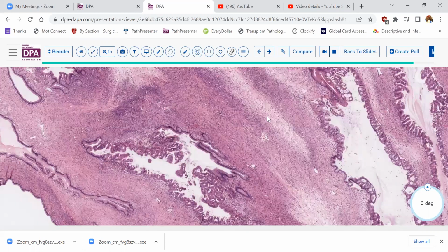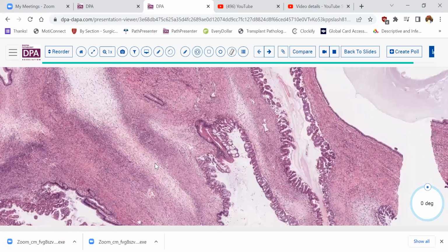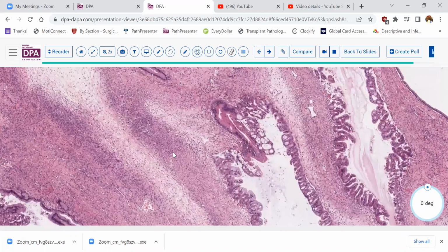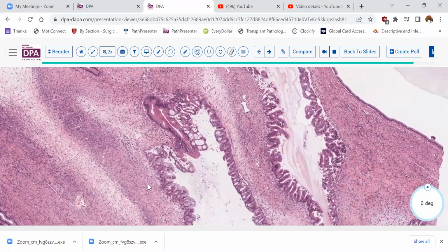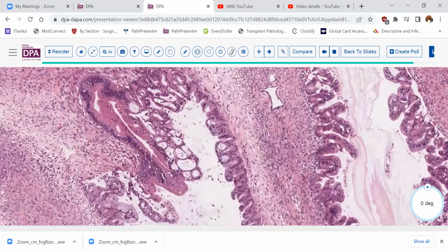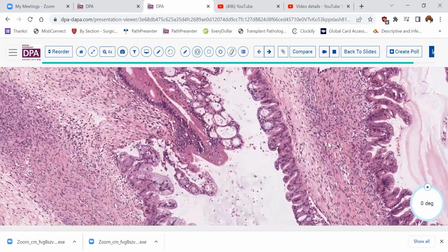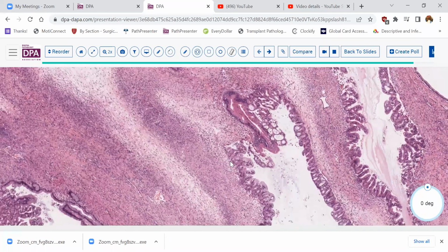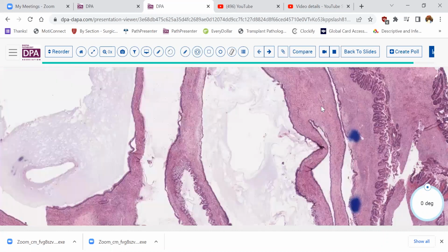In the new WHO classification for these tumors, however, there's mention of two additional stages in borderline tumors. One is the presence of intraepithelial carcinoma, which I'm not sure that we're getting there with these areas, but I'll show you another area in this lesion, which I think would be convincing to you.